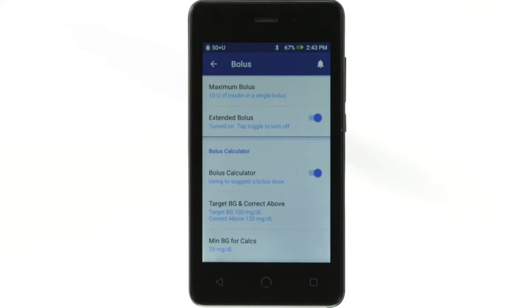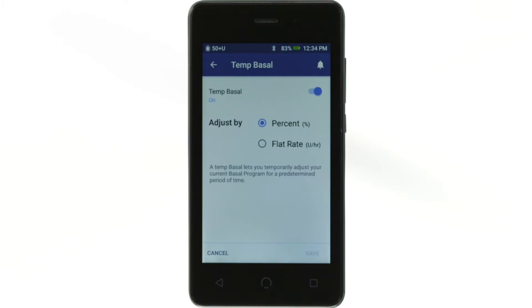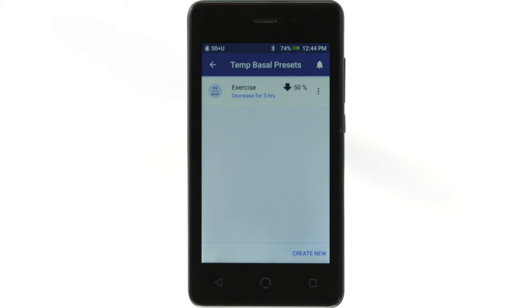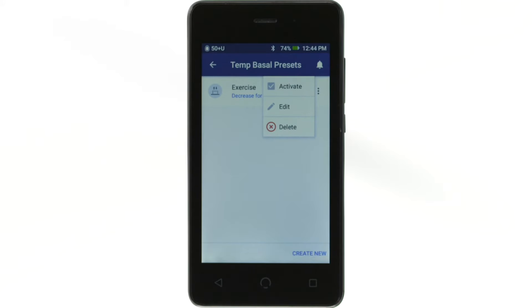While using the PDM, you'll also encounter toggles, checkboxes, radio buttons, and dropdown lists. Options icons appear on the right side of certain lists. Tapping the Options icon brings up a list of options relevant to the item in that row.